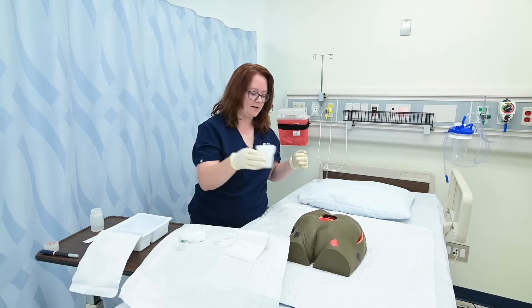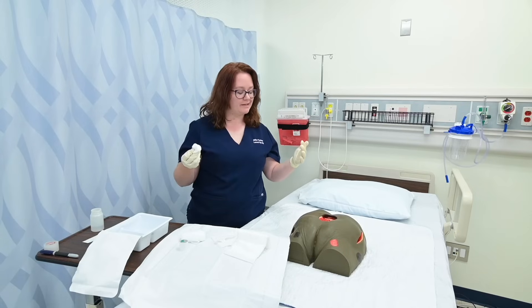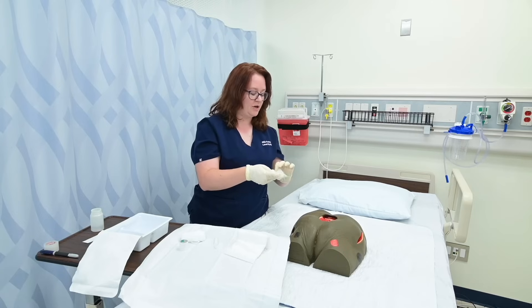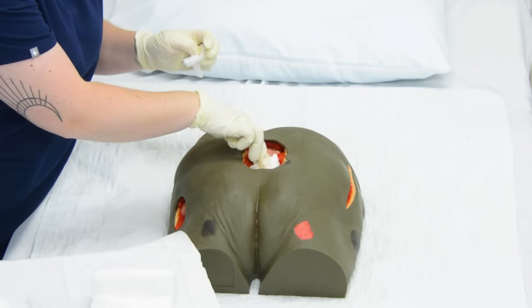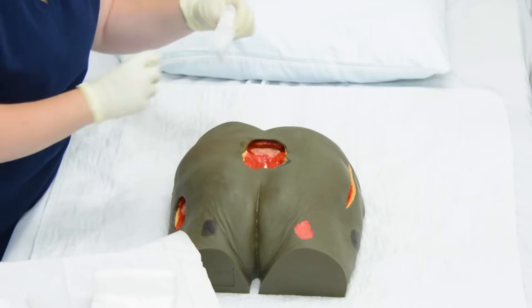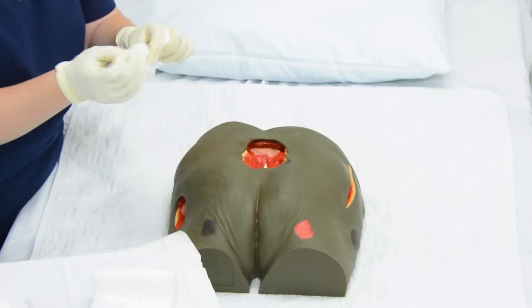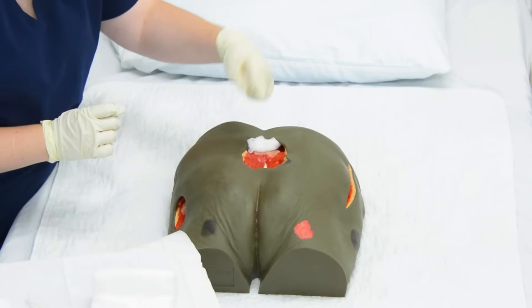Once it's clean, I'll take an additional piece of gauze and pat it dry, just to make sure there's not an excess of liquid in my wound bed. Then I'm going to take whatever material has been ordered to pack it with — in this case, we'll say that's dry gauze. I could at this point put any type of medication or ointment if that were ordered. It's important to be very careful when placing this gauze — I need to put it into those holes without dragging it over the outside of the skin, rather than rolling it over the wound edge and tucking it in.